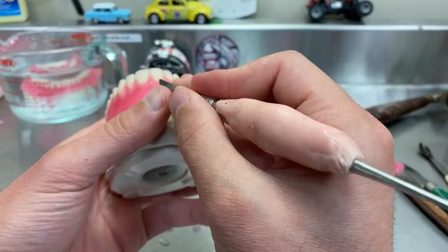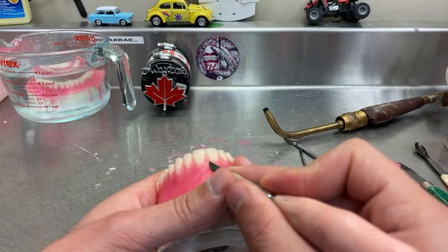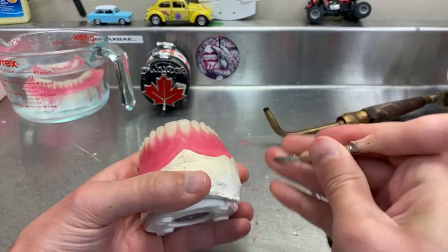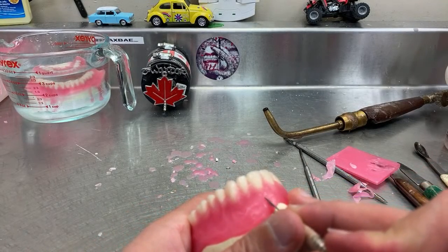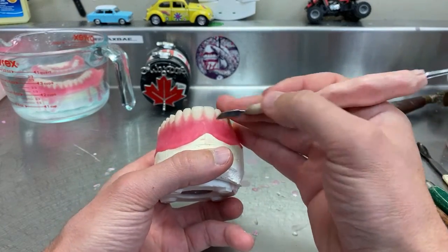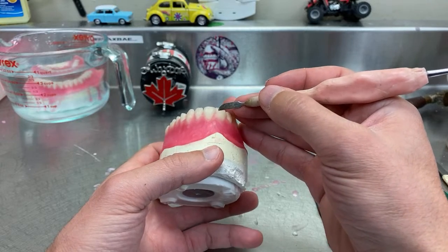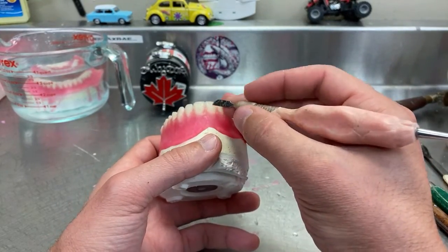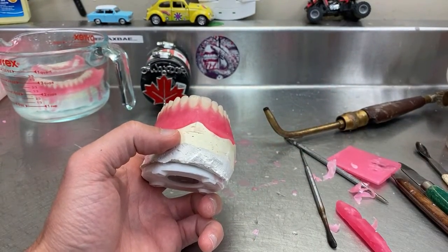Okay, so I like to start here, and what I do is you first see where the teeth are, how far you want to expose them. All of these things actually are important because you want to know, as I said, aesthetics. It will be either showing too much teeth because it's an older patient, showing less teeth because it's a younger patient, they still have a healthy look, or it's an older patient but wants a younger look, so you give them just a standard carving.